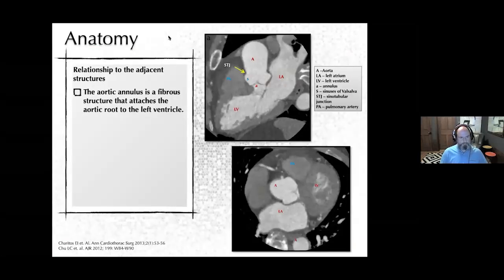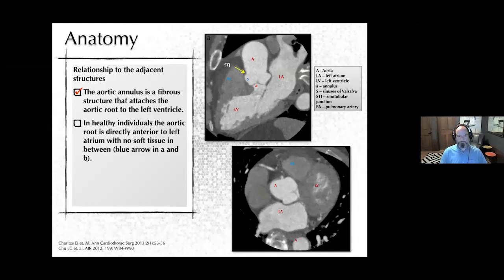The aortic annulus is a fibrous structure that attaches the aortic root to the left ventricle. Here we see the LVOT, ascending aorta, left atrium, left ventricle, pulmonary artery, and sinotubular junction — where the tubular part of the aorta meets the sinuses of valsalva. In healthy individuals, the aortic root is directly anterior to the left atrium, so we should have no soft tissue in that retro-aortic space. We want to make sure we can clear this space in all patients with suspected aortic root issues.